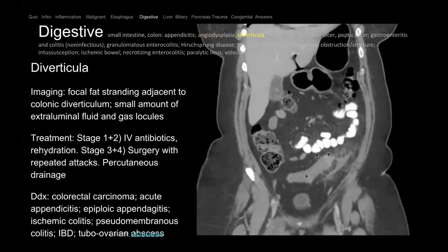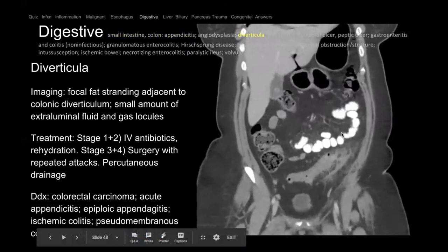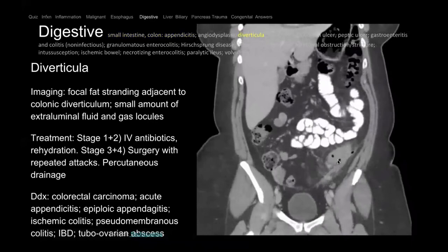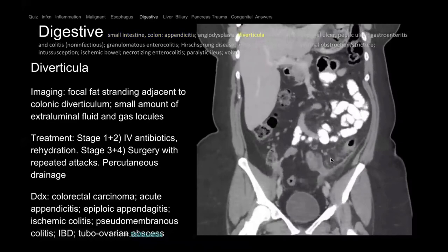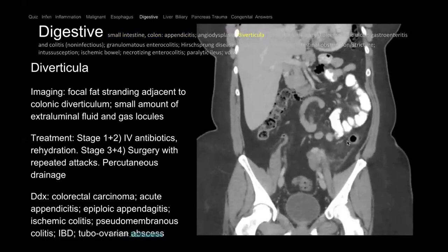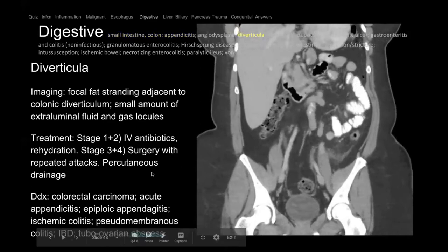Here is a patient with left lower quadrant pain. This is a CT abdomen and pelvis coronal with oral and IV contrast. The portal vein is lit up and the patient has diverticulosis. In addition, there's bowel wall thickening, thickened pericolic fascia, and mesenteric fat stranding due to fluid. This is a complication of diverticulosis — diverticulitis — and it's simple with no abscess. Sometimes it can perforate causing abscesses that need drainage, or fistulize into the bladder or vagina. Patients need colonoscopy follow-up because it can mask colon cancer.